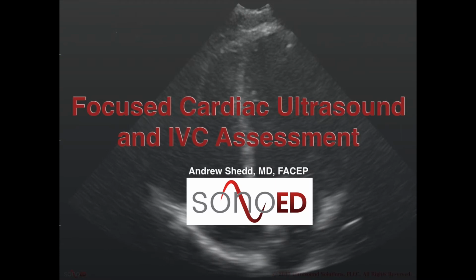Good morning. Welcome to another ultrasound lecture. This is going to be one of my favorites: cardiac ultrasound in the emergency department. We're also going to be talking about assessment of the inferior vena cava. This is really a crucial ultrasound within the field of clinical or point of care ultrasound, and particularly within emergency medicine, because we see so many patients who can benefit from this ultrasound at the bedside.